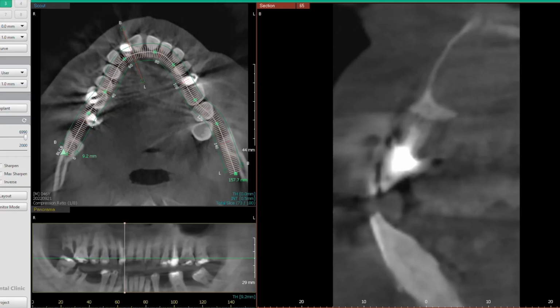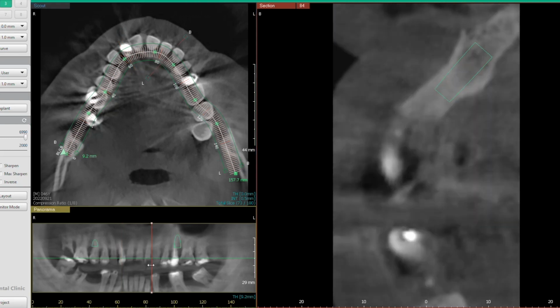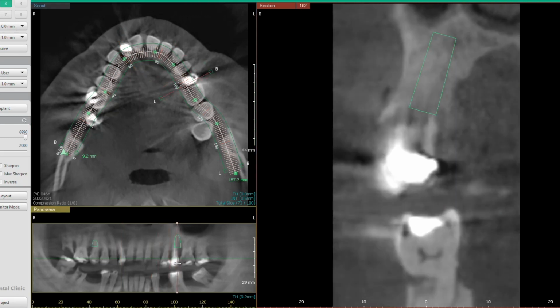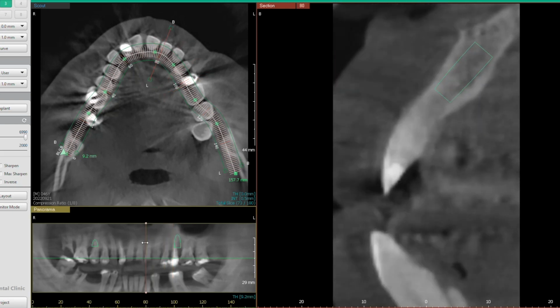So now here's the cool stuff, right? When you look at that 3D scan, you say, all right, so where would I place my dental implant? So let's do that real quick. What I did here was I basically acted like I was placing some dental implants. So I placed a dental implant here in the upper left, and this is what it looks like engaged in the bone. And then as I scroll across, here we go. We have another implant on the upper left area, and this is what it would look like in the bone.